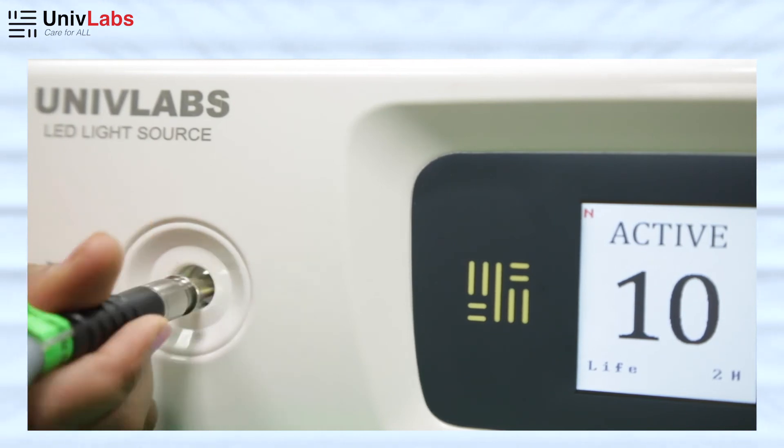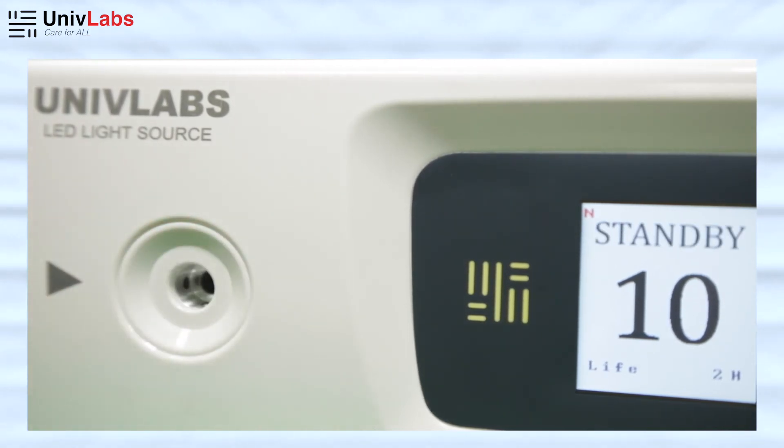When you take out the cable, the unit goes back to Standby Mode as it has memorized the last unit of sensitivity. It switches back to Active Mode once the cable is inserted again.